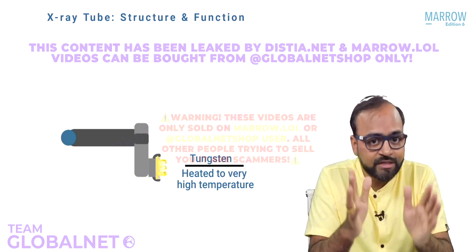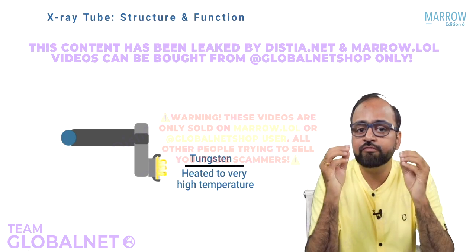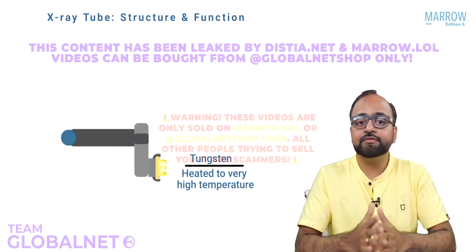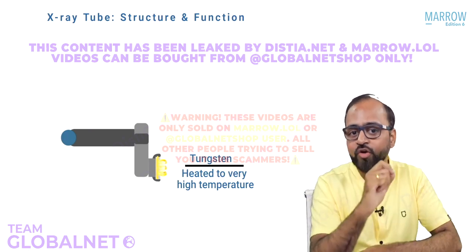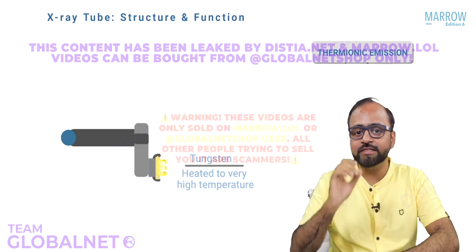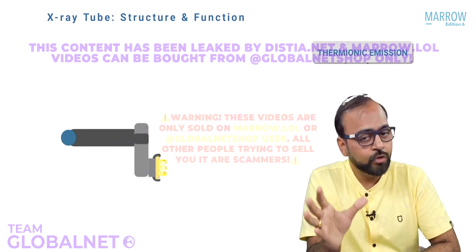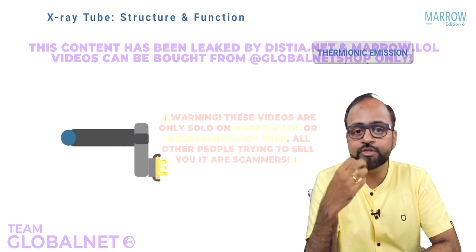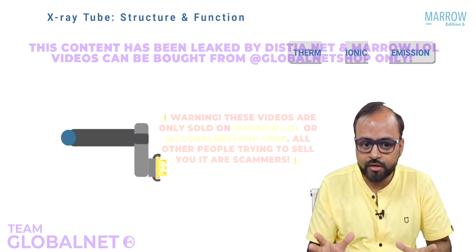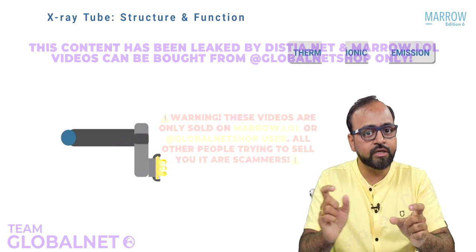Now when it gets heated to very, very high temperatures, there is a very beautiful phenomenon that occurs at the level of the cathode filament. This phenomenon is called thermionic emission. Don't worry, it is a big word, but I'm going to simplify it for you. Let us split it up into three parts. Look here, thermionic emission.